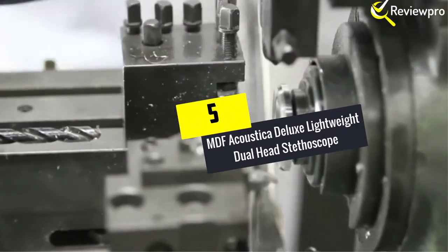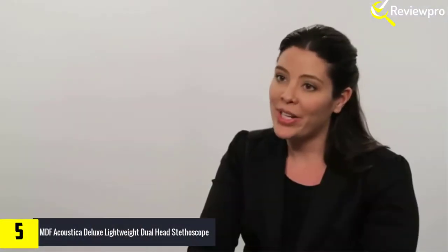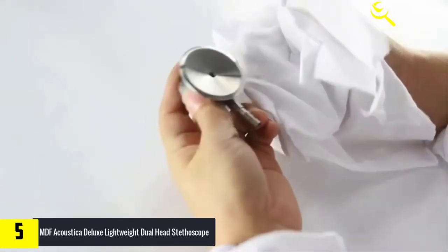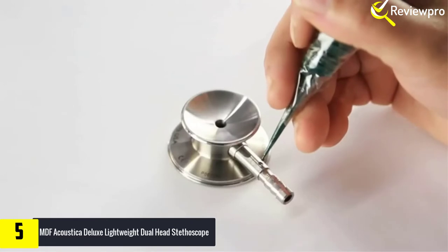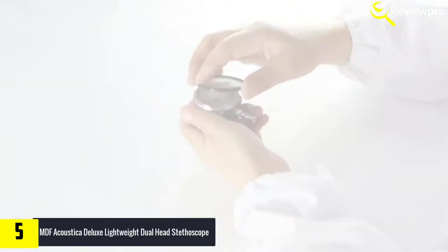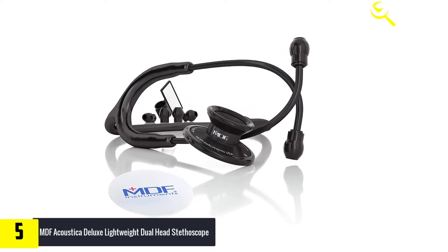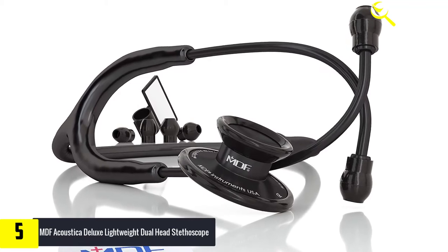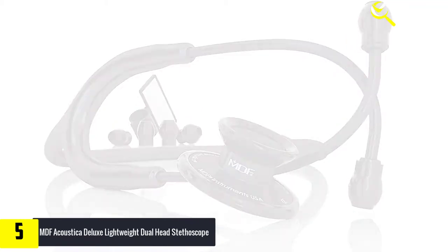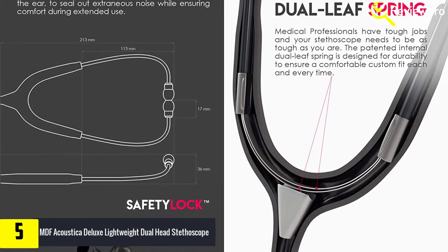Starting at number five, we have the MDF Acoustica deluxe lightweight dual head stethoscope — a latex-free stethoscope from MDF Acoustica. This product serves as a reliable diagnostic tool that offers precise detection of carotid, lung, and heart sounds due to the acoustic sensitivity and clarity of the instrument. Made from high-quality aluminum, this stethoscope is lightweight and comfortable to use. It has a dual head design for the chest piece that makes it durable, and the acoustic valve stem has a full rotation feature with a green dot indicator to let you know the active sound channel.